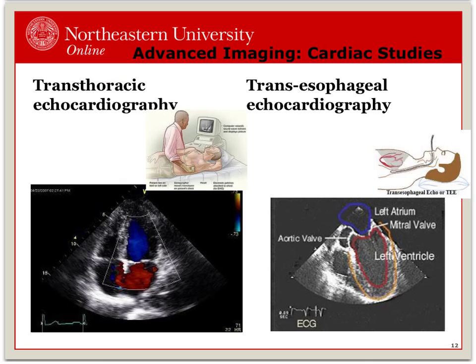When cardiac disease is identified, further imaging is indicated. An echocardiogram is a test in which ultrasound is used to examine the heart. It provides single-dimensional images as well as more advanced imaging. It is capable of displaying a cross-sectional slice of the beating heart, including chambers, valves, and major blood vessels that exit from the left and right ventricles.